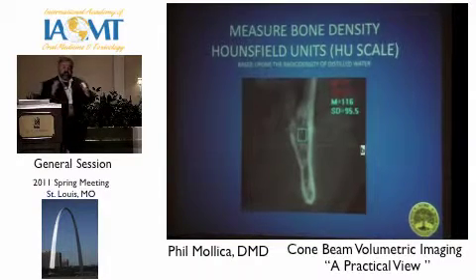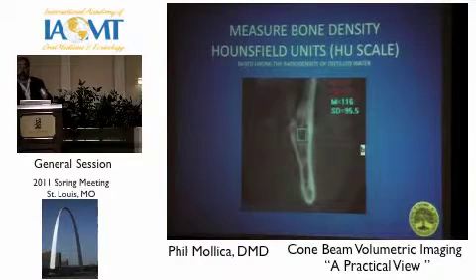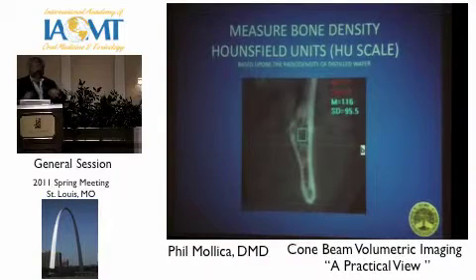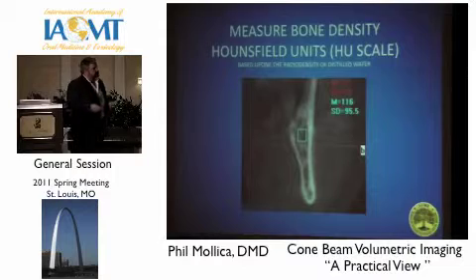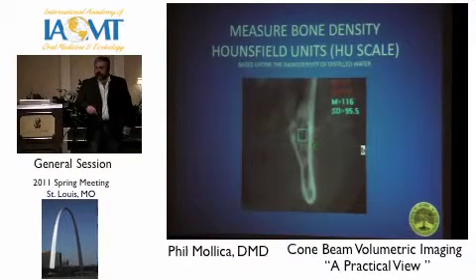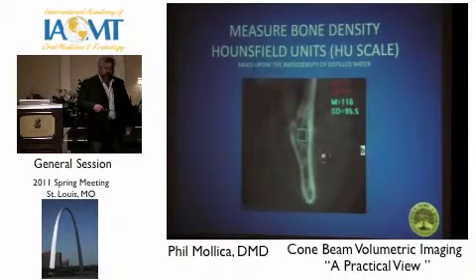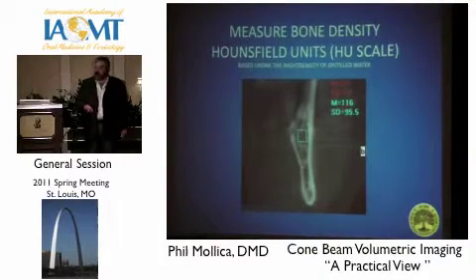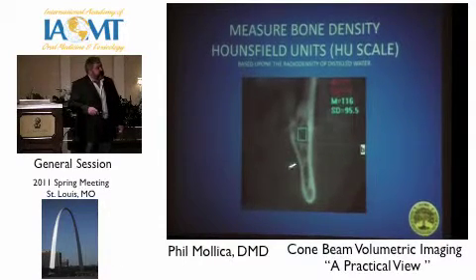We always thought cavitational osteonecrosis, or infective osteonecrosis, was really problematic. That's not the problem. What's problematic is when all your osteoclasts fall away and are poisoned. But we have this thing called Hounsfield units, so we can actually measure bone density. Typical bone will be in the range of about 400. You get into medullary spaces, it drops down to around 200. But you get into these areas where you have infective states, where the body's trying to buffer the infection you're dealing with, you get loss of density.